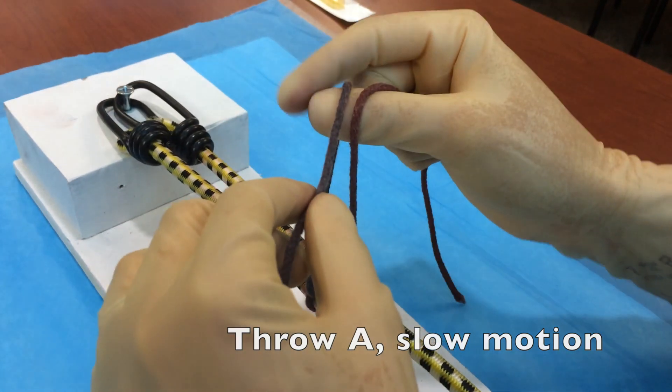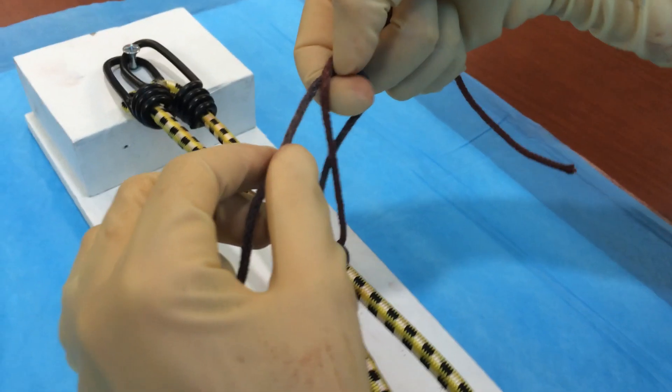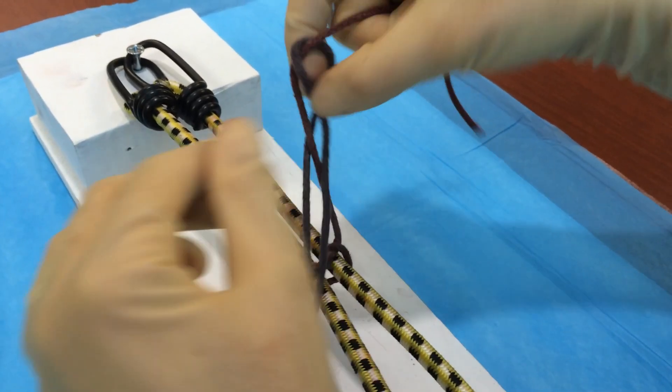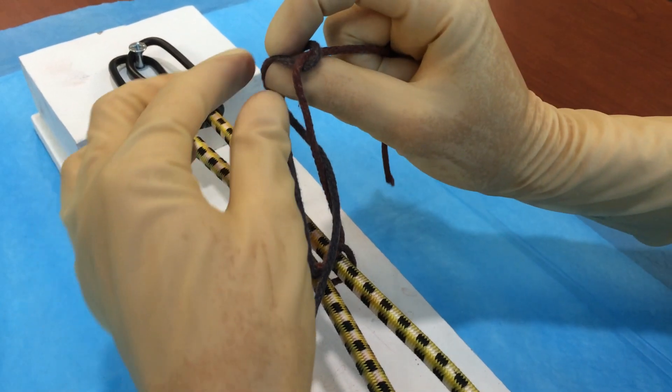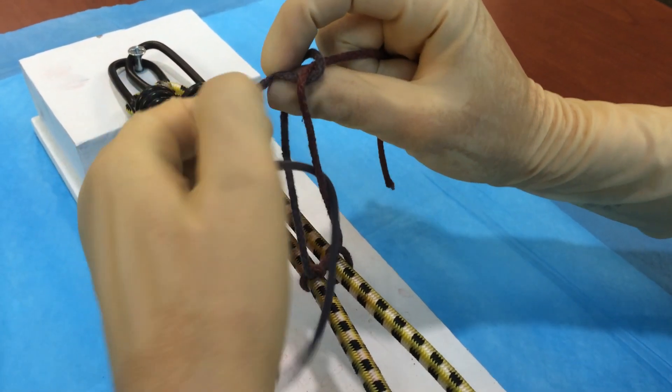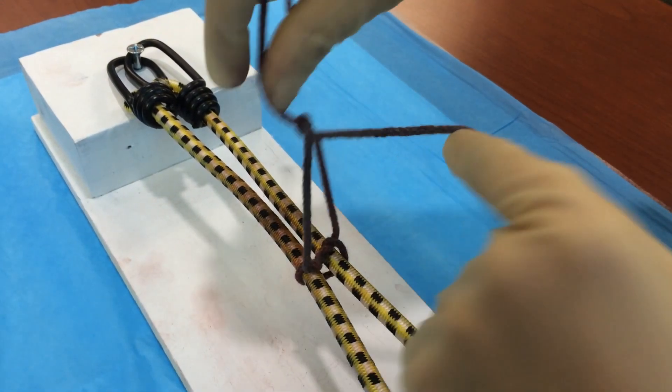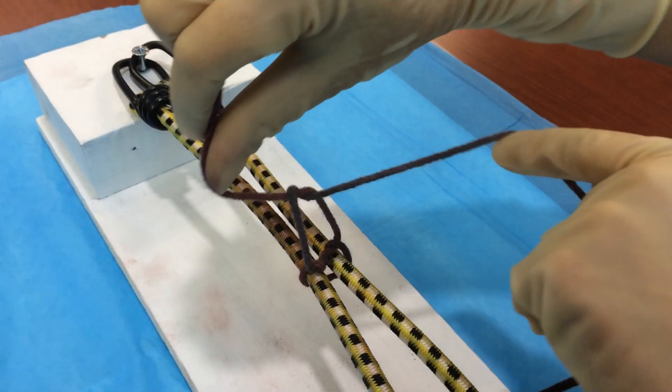Firstly, we take the strand in our left hand and cross it over our thumb. We create our bird's beak and then we grab that free strand from our left hand and we push it through the loop, retrieve it with our left hand, and then pull it taut. Notice in order to get the knot to lie flat, we'll have to cross our hands slightly across the margins of the wound.